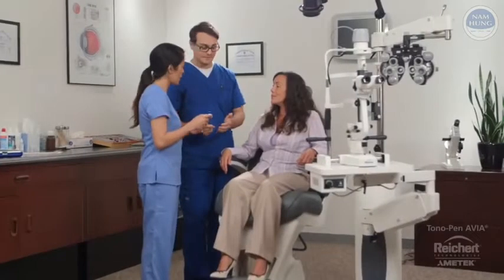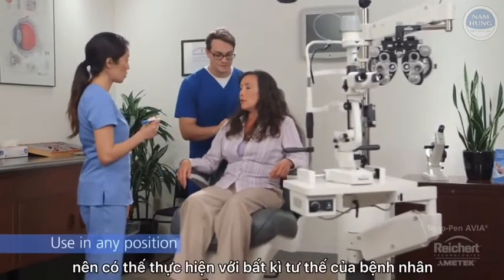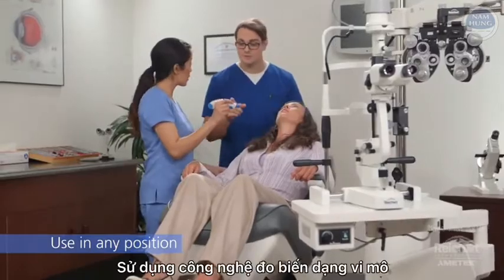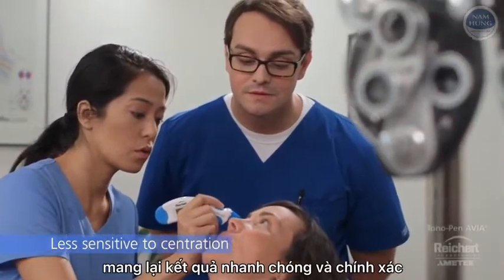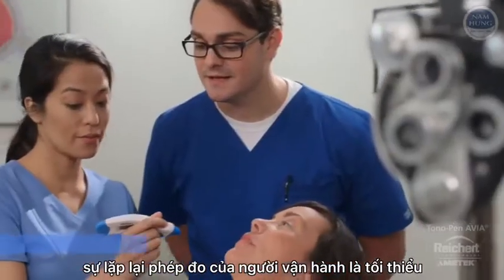Now it's Amy's turn. Tonopan Avia is gravity-independent and can be used on patients in any position. Its micro-strain gauge technology is less sensitive to corneal centration than other tonometers and provides fast, accurate, and repeatable results with minimal operator bias.